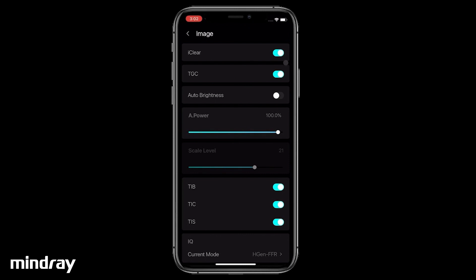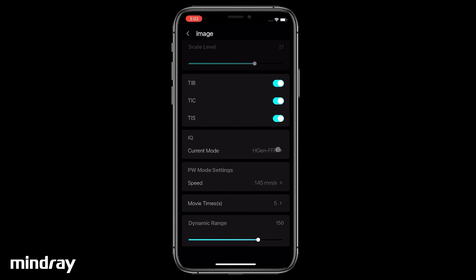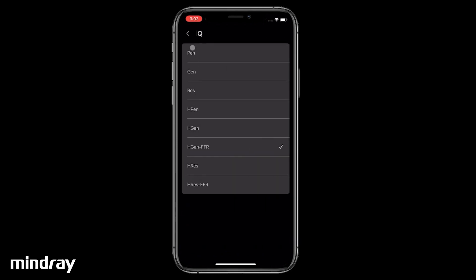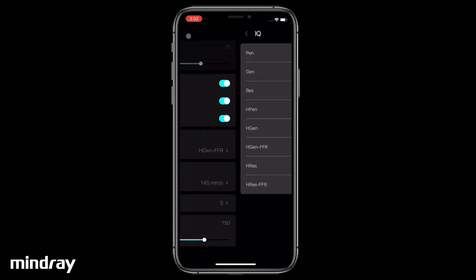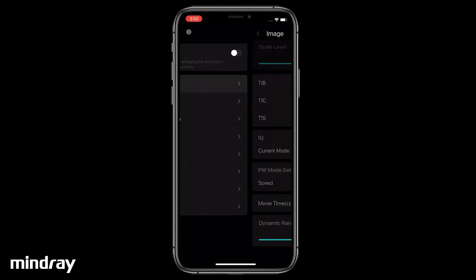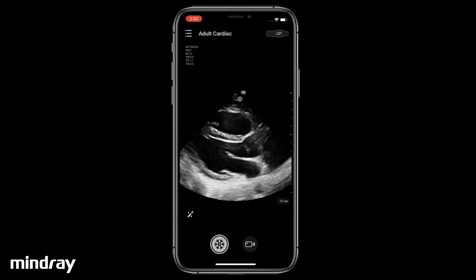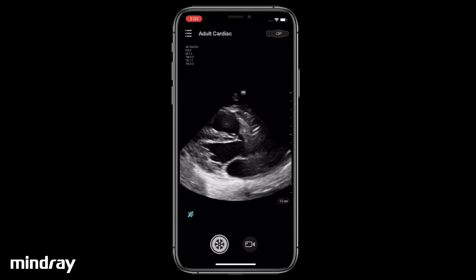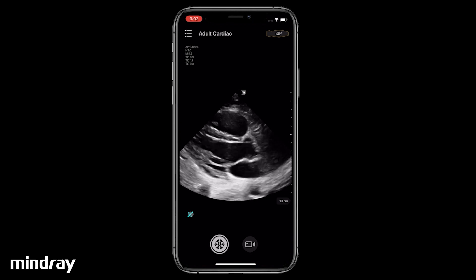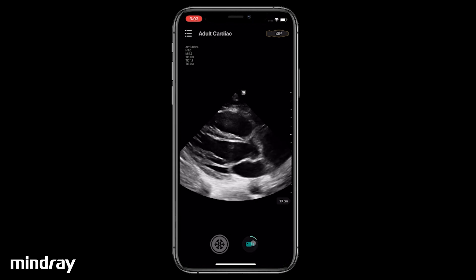Disable or enable TGC adjustment. Change the transmitting frequency for optimal image quality. Adjust dynamic range for proper image contrast. Tap the Eye Touch icon for automated image optimization if you are unsatisfied with the manual adjustment.